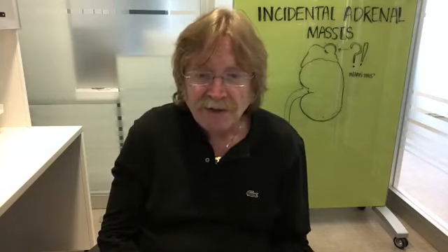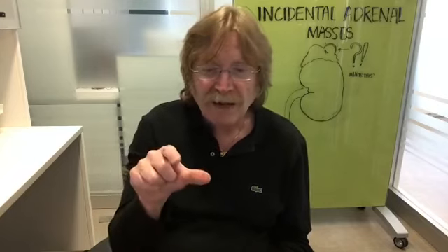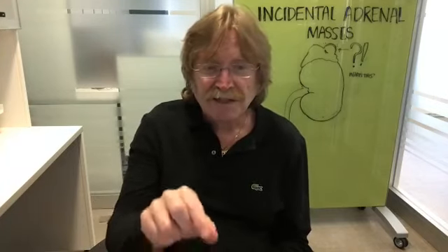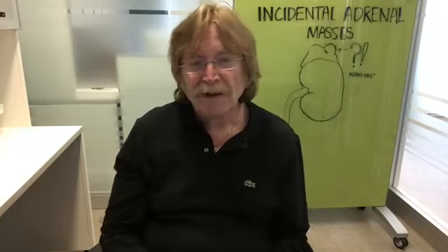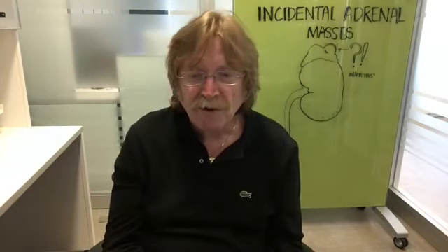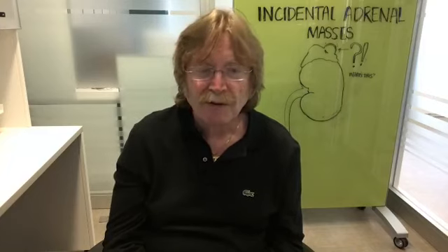Let me see, Sharik, one basic question. When measuring absolute washout, how much of a region of interest should we cover? I like to do about a centimeter. You've got to be careful, and maybe I'll measure in a few places. Of course, if there's low density central, you want to measure that. Maybe it's fat, but you want to measure around. 1 cm works well. Sometimes people talk about larger cursors. I always find 1 cm works well. It's very reproducible. So anyway, that seems to not be too much of a problem.